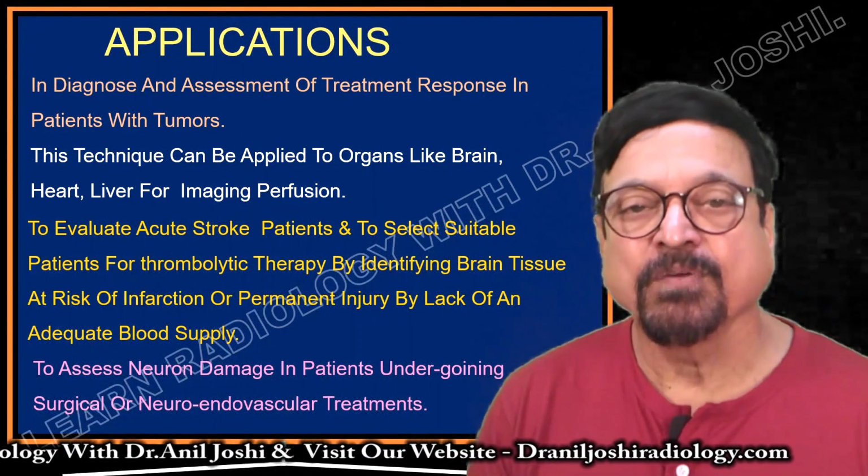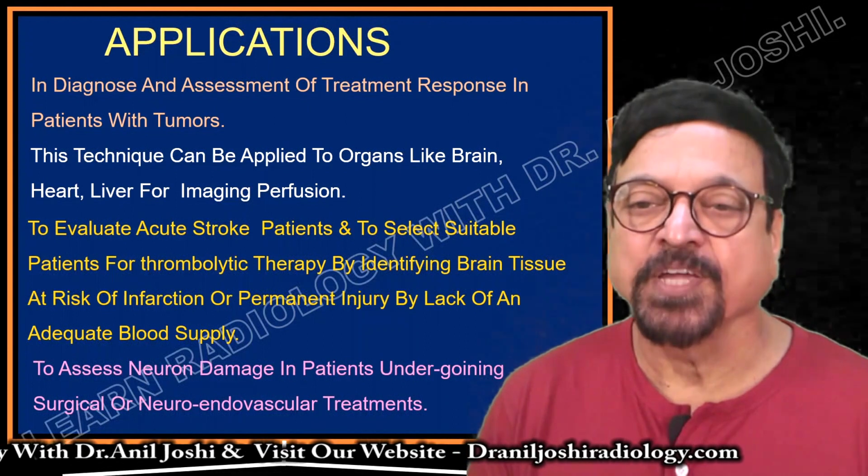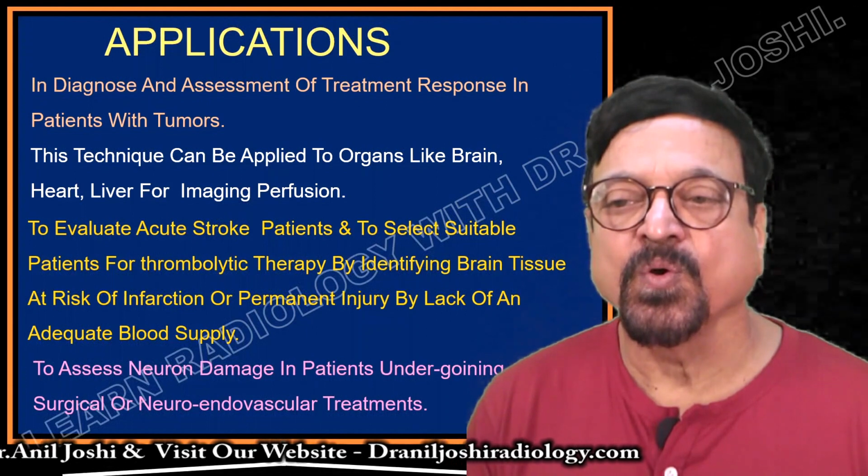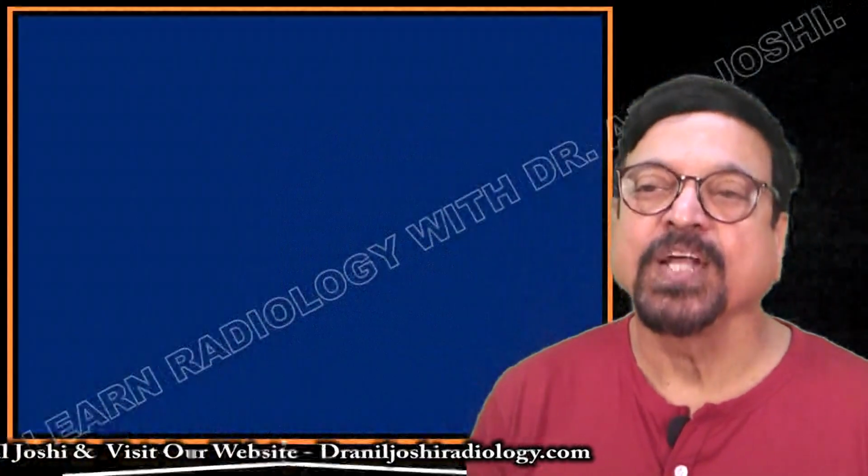For that, we have to perform it in time. Immediately a treatment has to be given. To assess neuron damage in patients undergoing surgical or neuroendovascular treatment, this also helps a lot.